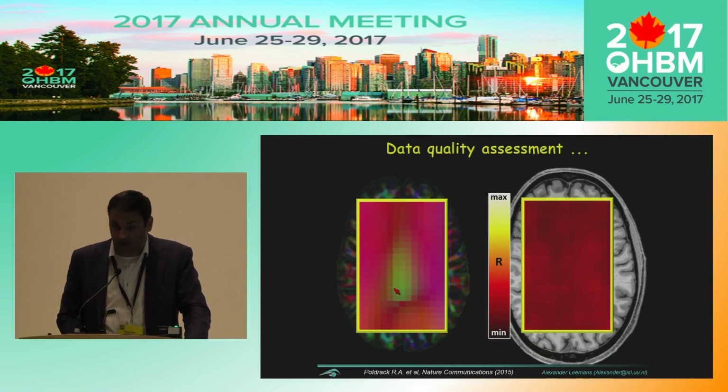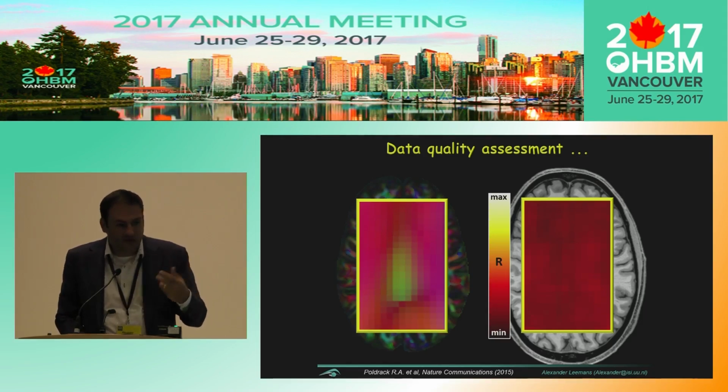is very prominent. But this is an extreme case, I would argue, because here the dominant diffusion orientation is actually front to back in green, compared to the left-right from the corpus callosum, what you would expect. Okay? But again, I want to focus here on the residual map. It's very convenient to disambiguate, like, okay, what am I actually looking at?